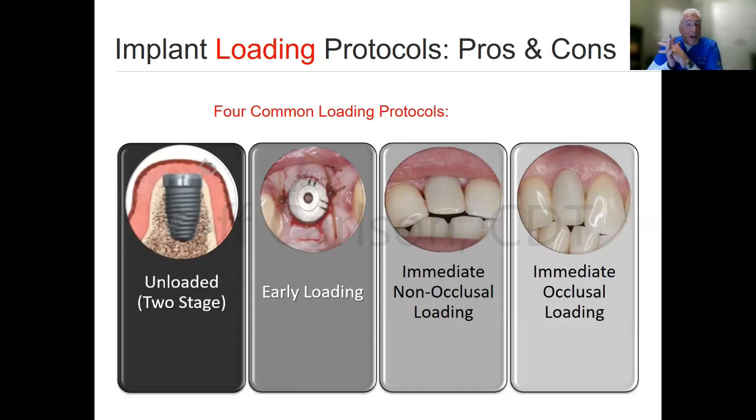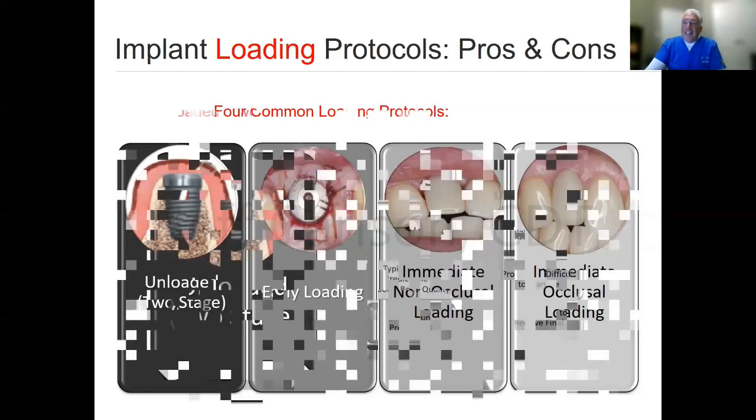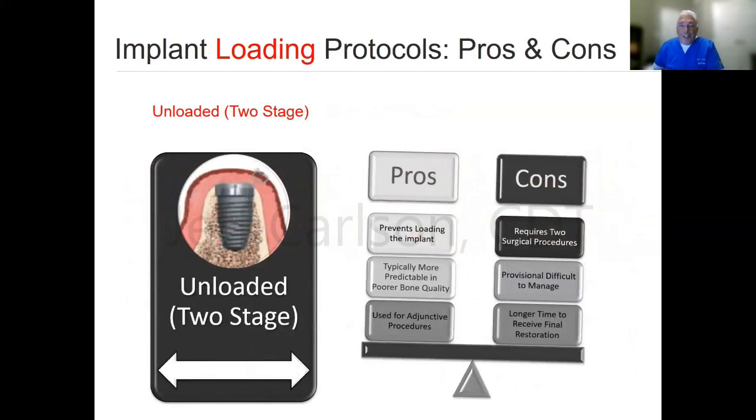And that's the weakest part of the bone to implant interface, after that 7 to 10 day period, upwards to maybe somewhere closer to 6 weeks, maybe as much as 8 weeks, based on a lot of conditions: patient's health, smokers, non-smokers, uncontrolled diabetes, things like that. They're way over my head. I'm just a technician, so a lot of these things, I'm just restating what I've heard from my clinician friends. So let's take a look at some of these protocols here.